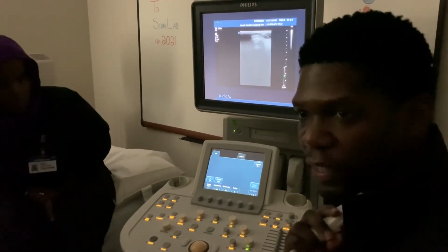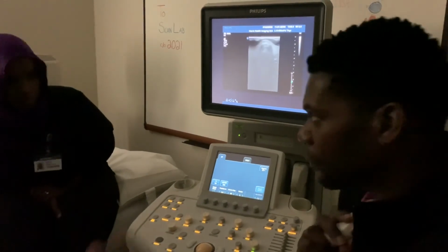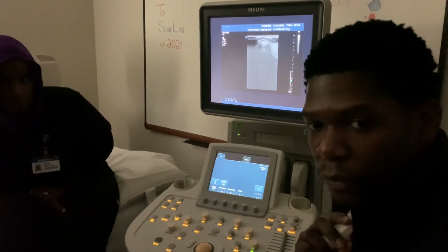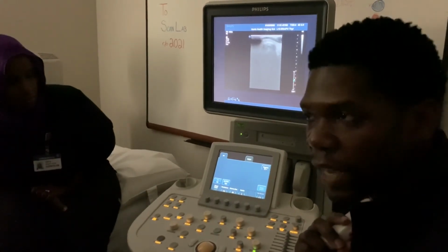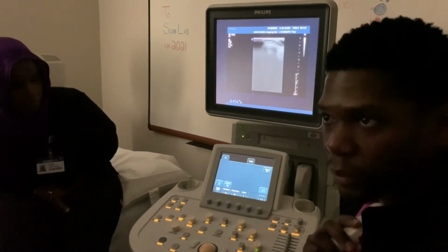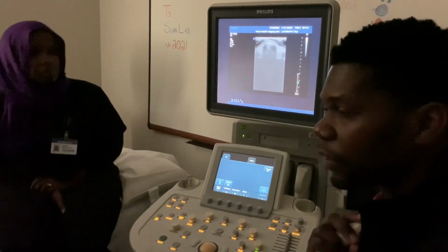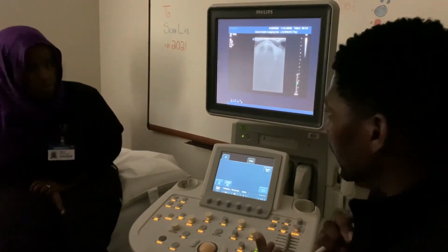In real life, you guys probably didn't even know it was there until I showed you some months ago when you first started. Well, no, I just remember the beginning of the school year. Right. But as far as the functional button, you guys don't really use it, right? But I'm telling you, if you want to use it, that's how you use it. Okay. What about TGC? TGC, those are the knobs, and that's a receiver function as well. That affects the brightness at different depths.